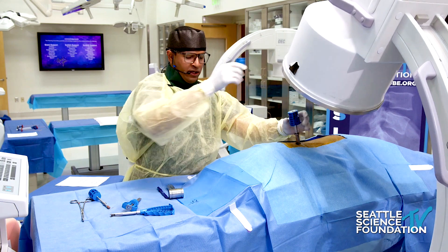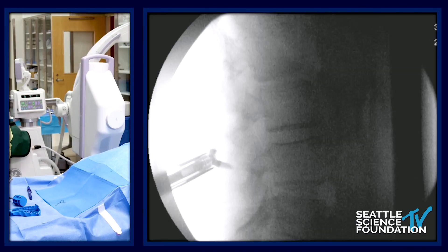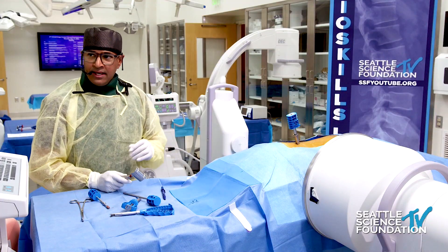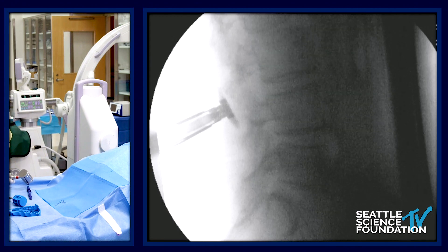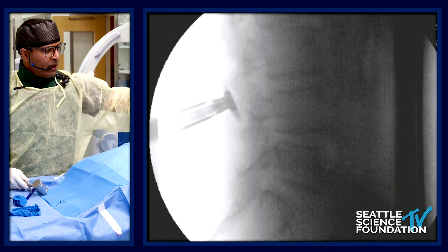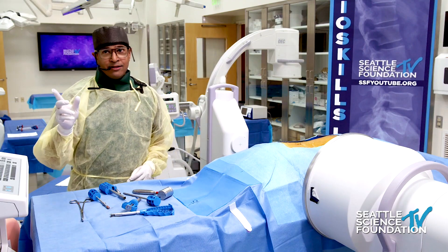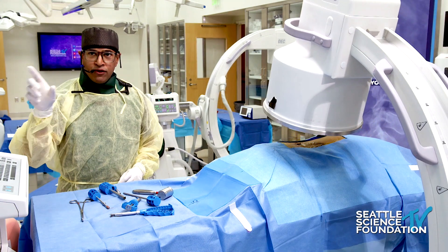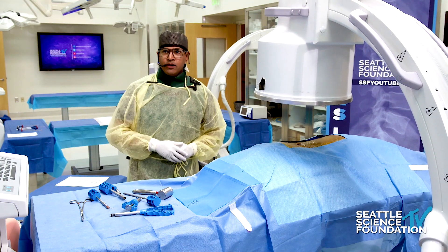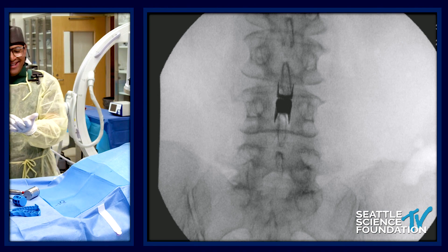I take out the driver — the blue handle — then mallet the outer cannula straight down to the spinal laminar line. There's an audible thud when you're on the lamina. Lift up the lever in front, side-to-side shake, and take everything out. You have to save these final fluoro shots. If there's any issue like dislodgement and you don't have shots in a court of law showing appropriate placement behind the spinal laminar line with cam lobes straddling the spinous process, you have nothing to stand on.